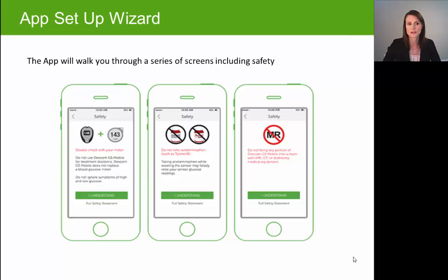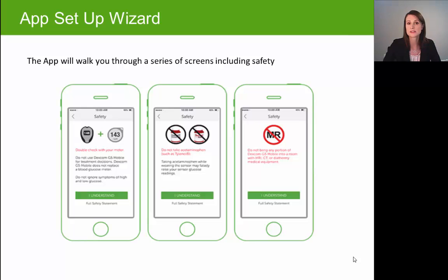You want to make sure you continue to base treatment decisions off of your glucometer reading, not your Dexcom value. The app will also talk about the contraindication with Tylenol, otherwise known as acetaminophen, which can create falsely high readings on your Dexcom. And it will remind you that you don't want to expose any component of your Dexcom system to an MRI, a CT scan, or diathermy medical equipment.